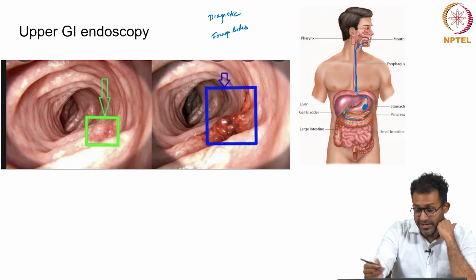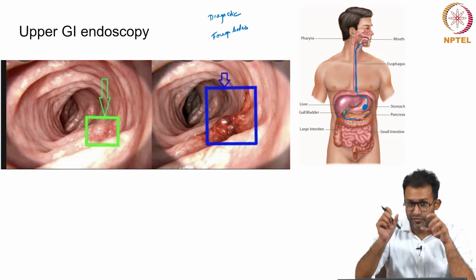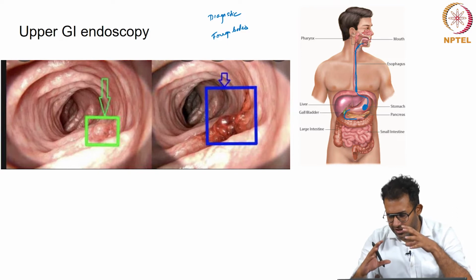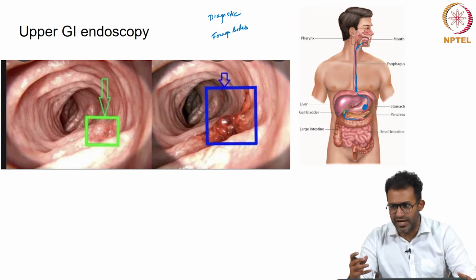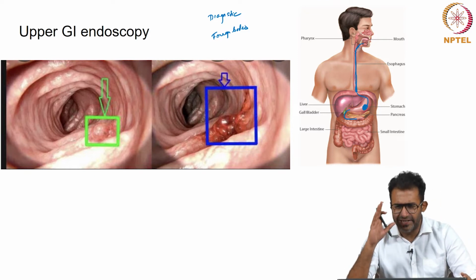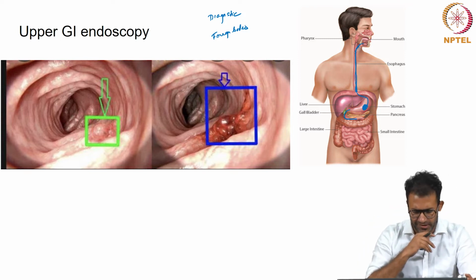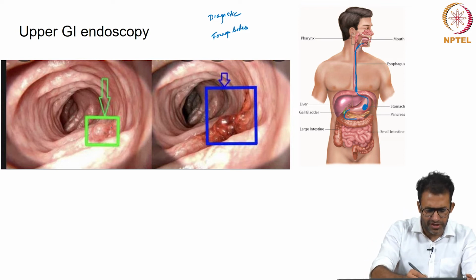In fact, it has advanced so much that if there is a small tear, or a perforation as we call it, you can even close those rents through endoscopy. So endoscopy as a field has advanced extremely well, and now we are even able to go into the biliary tract, which is the bile duct and the pancreas, to remove stones. That's all very technical stuff inside endoscopy, and that's not something we are going to do. Here what you see is an image where a computer vision tool has segmented lesions in an endoscopy.